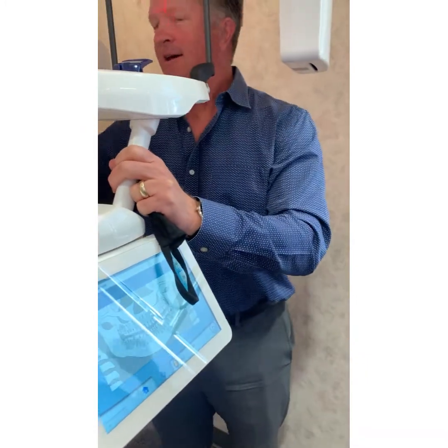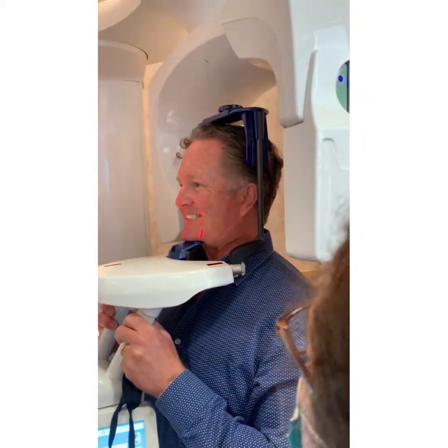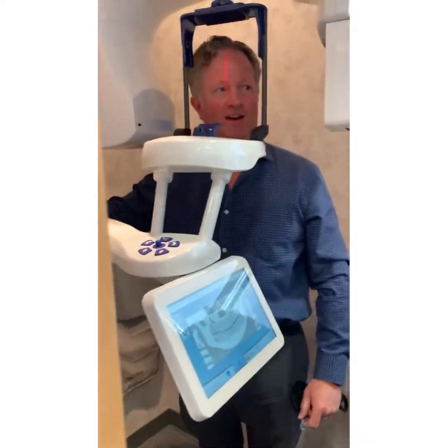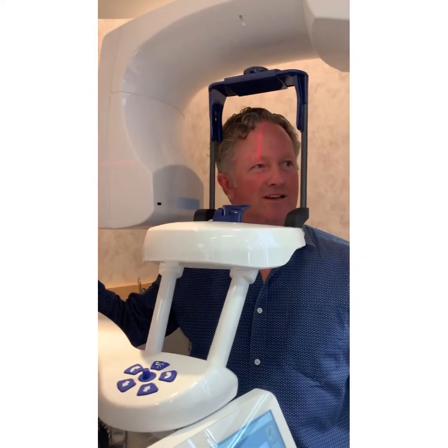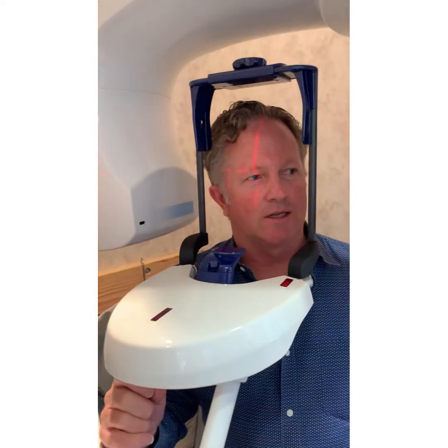Now, from where you were looking at me, can you see that my profile is flat? My chin and my forehead, neither is in front of the other, it's completely flat. The safe money is that my occlusal plane is on a 5-degree down angle. This Frankfurt plane light runs through the infraorbital notch and the top or middle of the tragus. If this goes out, no big deal, your pan's not down. This is what guarantees that my occlusal plane is on a 5-degree down angle. All I'm doing here is validating what my eyes are already telling me to be true.